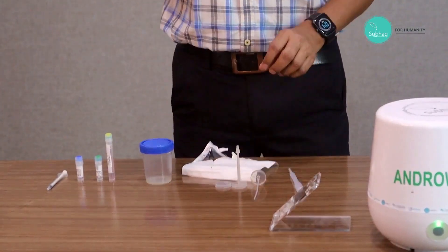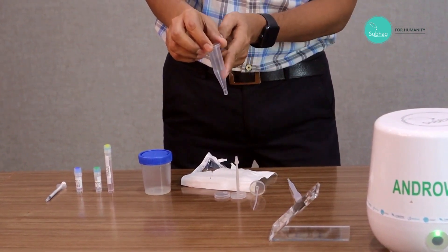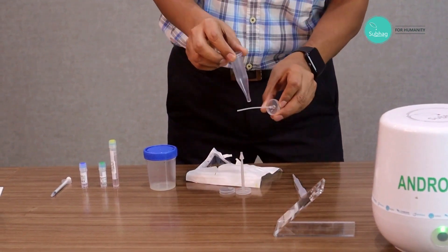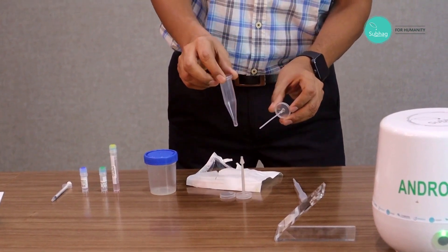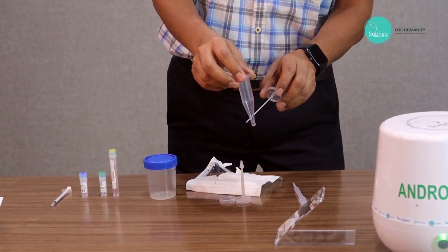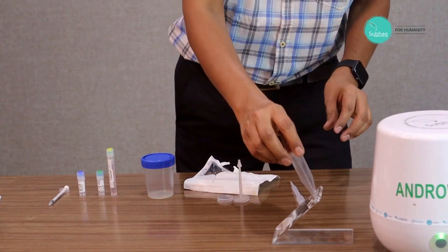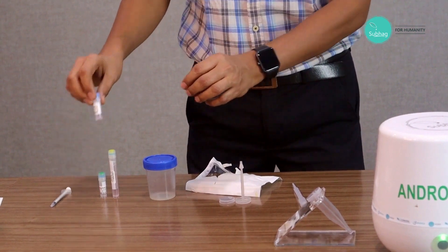To start the washing, we take the centrifuge tube. Typically we have a conical bottom tube, but in our case this tube is further extended. This design, plus the cannula base tube, actually helps us in layering. The cannula base tube opens at the end on two sides, so even if we input turbulent flow, because of this two-side opening and the extended design, it converts into laminar flow.